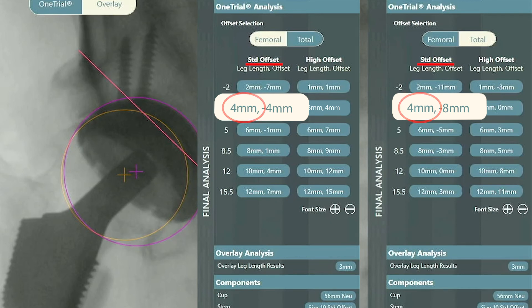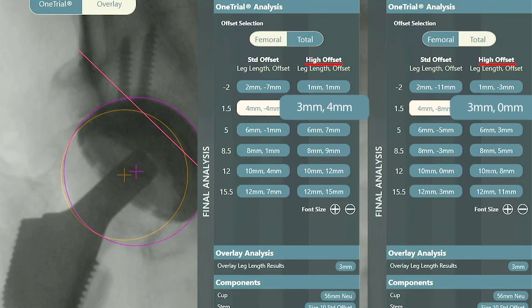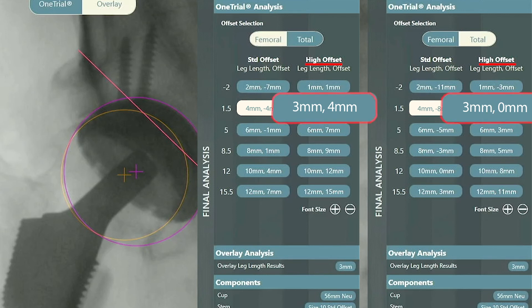However with the standard offset stem I have a negative femoral offset and a negative total offset. It's easy to see looking at this chart that if I select the high offset stem I'll give the patient the same amount of length but I'll have a positive femoral offset number and a neutral or slightly negative total offset number, which is my goal. I then select and implant the high offset stem with a plus 1.5 head.